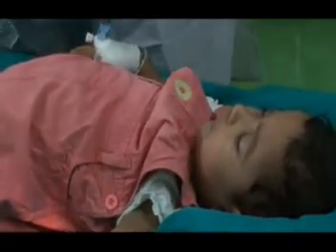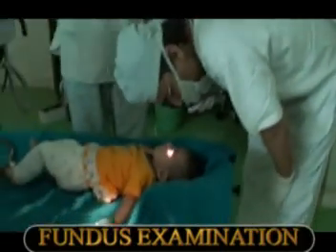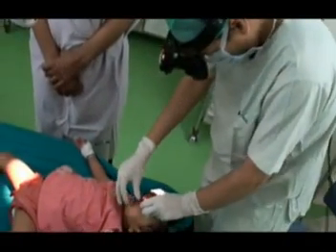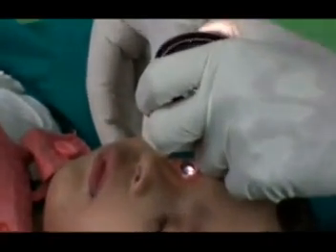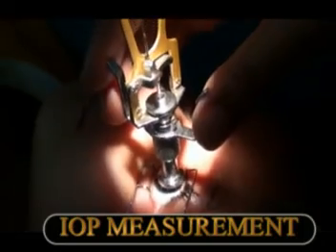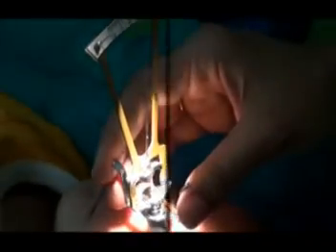Fundus examination should always be performed as they may have other problems, and indirect ophthalmoscopy may be more useful in these small children to see if there are any other associated eye problems. Along with that, we always check the intraocular pressure using a Schiotz or a handheld applanation tonometer.